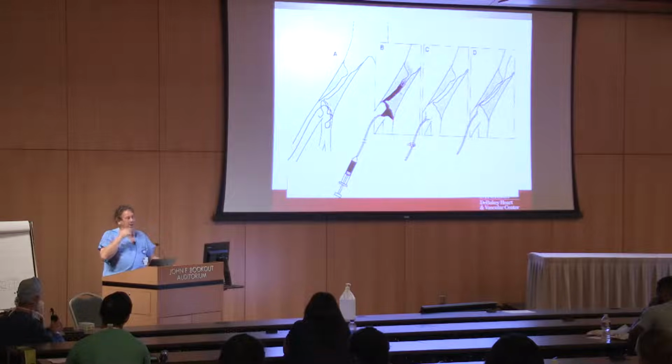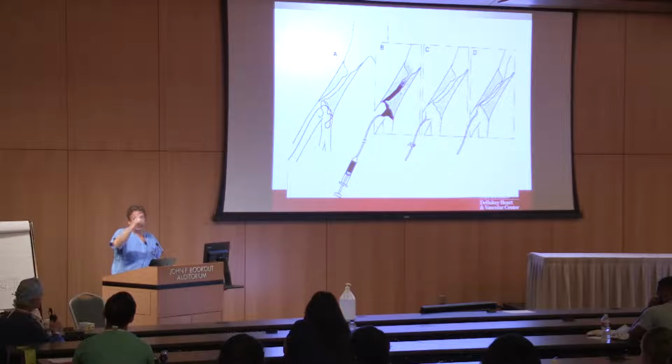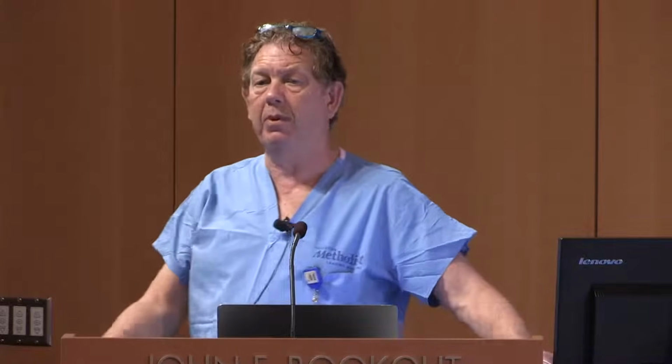Yeah, so basically it's an ultrasound chip on a catheter, gives you cross-sectional images. So you get that wire through it, and you pass the IVUS catheter, it will give you cross-sectional images looking into the wall of the blood vessel. It is ubiquitously used in dissections, variably used for occlusions. It tells you probably one of the most accurate ways of knowing what the diameter of that blood vessel happens to be, and it'll tell you a little bit about the composition of it.